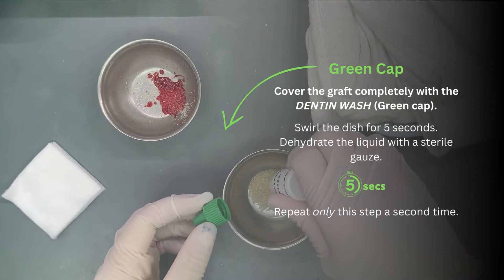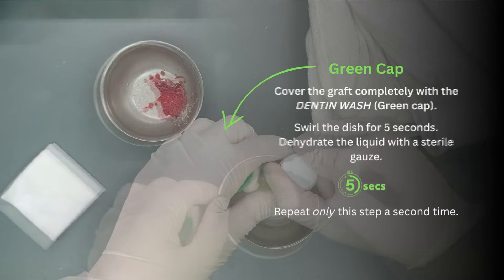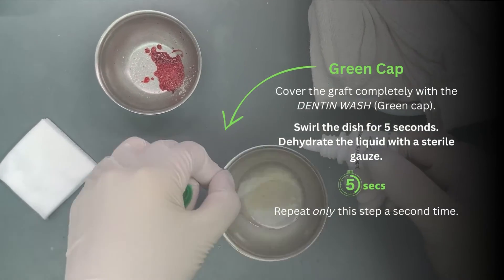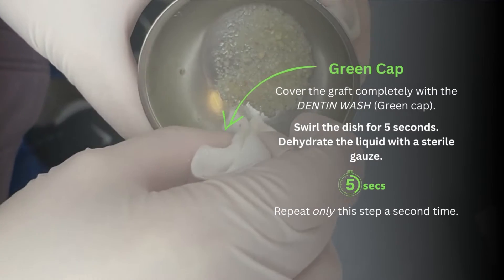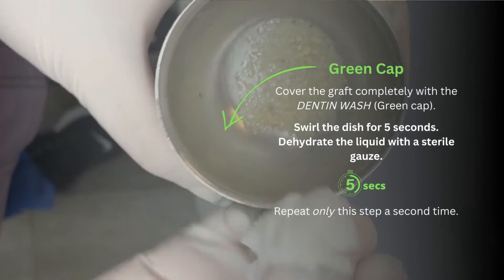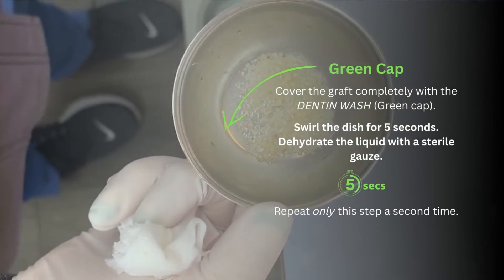Oh, that looks cool. Swirl it around. I'm dehydrating the liquid from the bone with some gauze and now it's ready to mix.